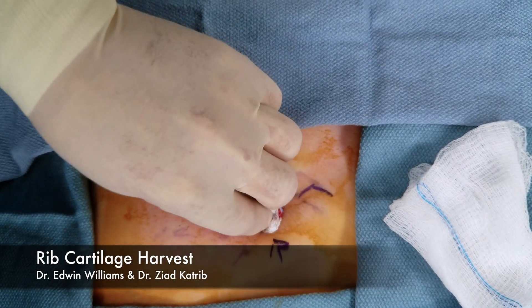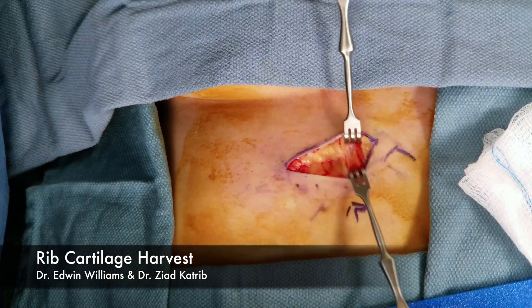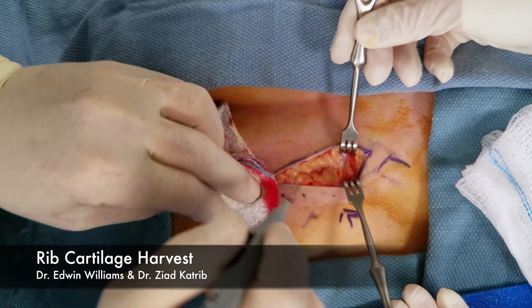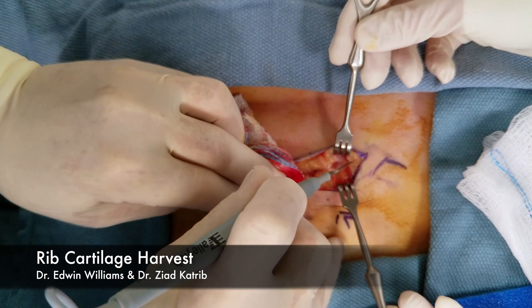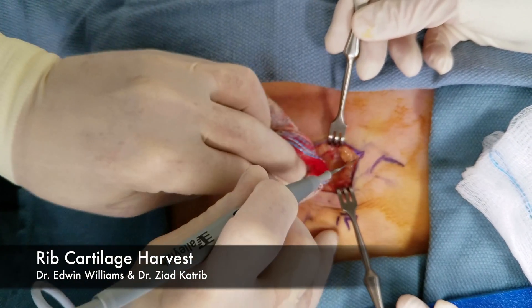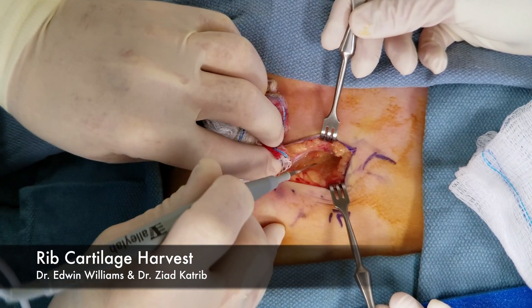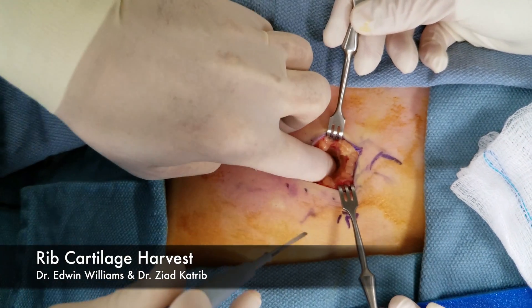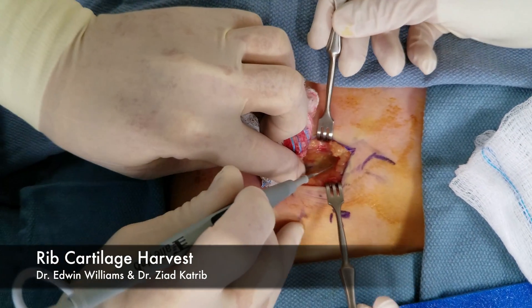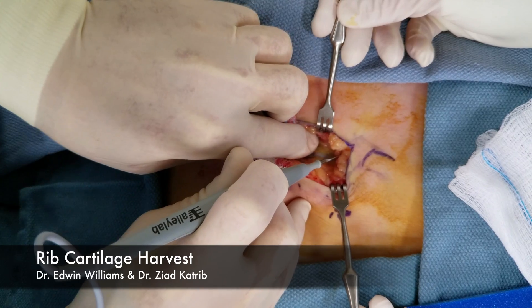Do a couple rakes and come around it. I know some people try to make this a really small incision, but it's tough to do and you do need to be able to see in there. There's my whole incision.